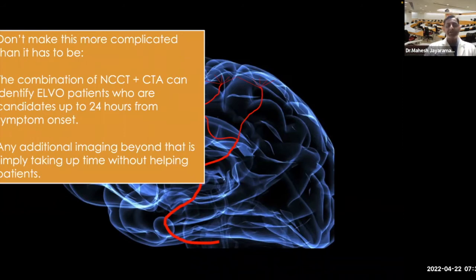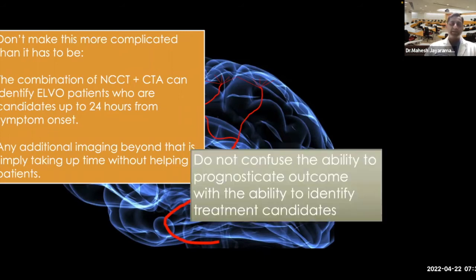I think that the combination of non-con CT and CTA can quickly and easily identify ELVO patients who are candidates up to 24 hours from symptom onset. And I think that any additional imaging beyond that is simply just taking up time without necessarily helping more patients. And the big part of this is, additional information from CT perfusion or MR can be very helpful for prognostication, but prognostication is not the same as helping you make a treatment decision.